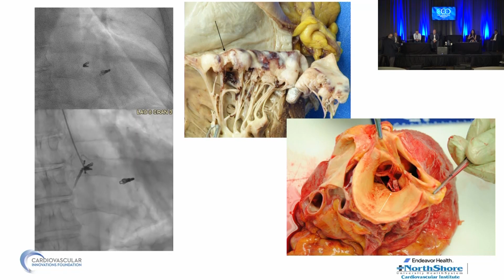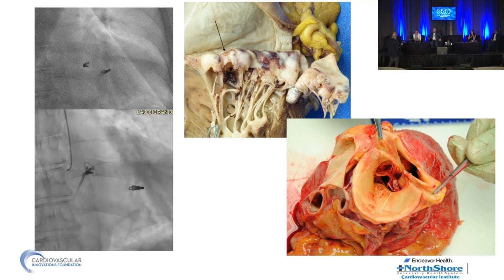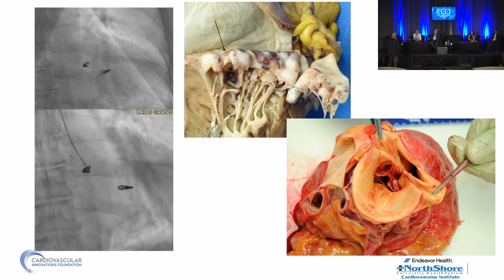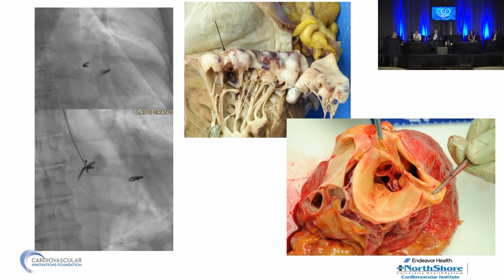I still get nauseated when I talk about this case, but maybe next year I'll be ready. I think this has been reported. It has been. Wow. So this is your case? No, it's my partner's case. And is that the patient's heart? That's the patient's heart. It's amazing the clip was in there on autopsy. It didn't spill out when they drained the heart. Really wedged in there. A lot happened before this: RP Impella, RV infarct, all that stuff. A crazy case. Anyway, that's not the type of plug you're looking for.